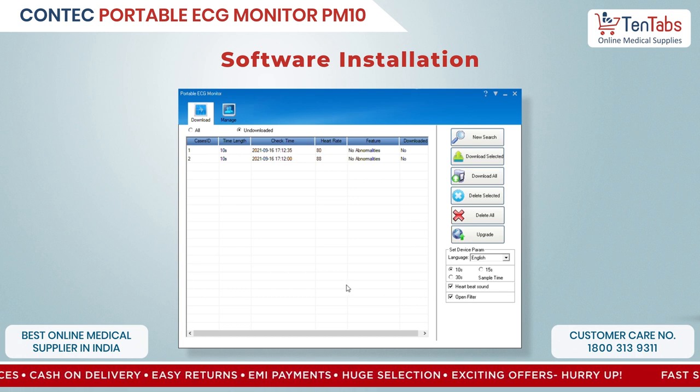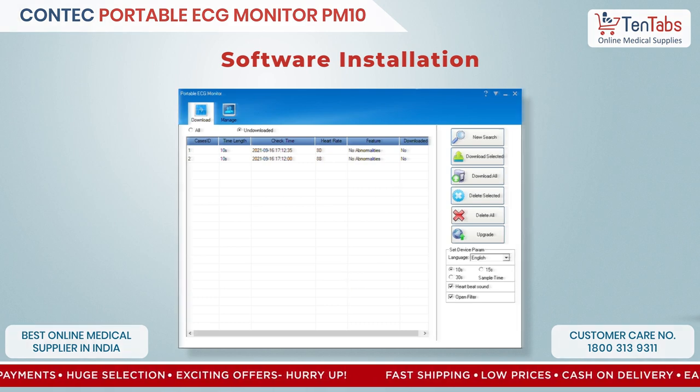This is the installation and unboxing video for the Contek PM10, which is a handheld ECG monitor. Thank you.